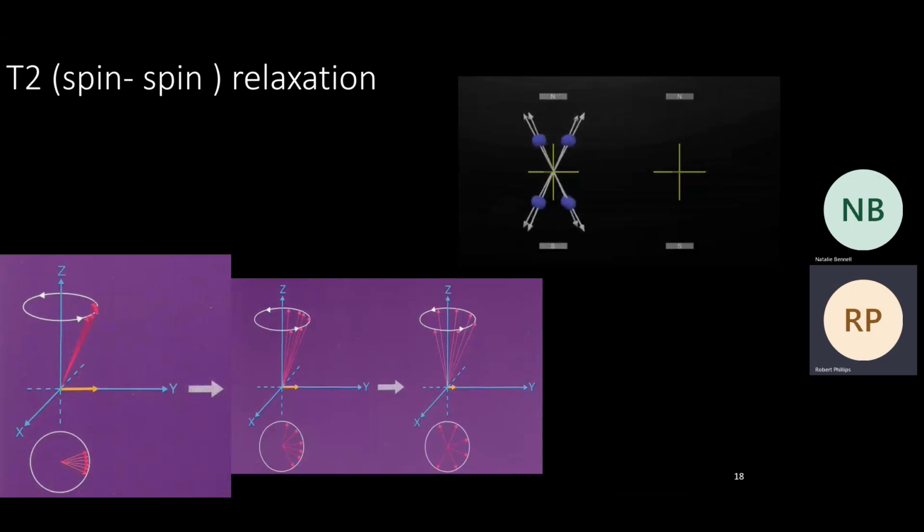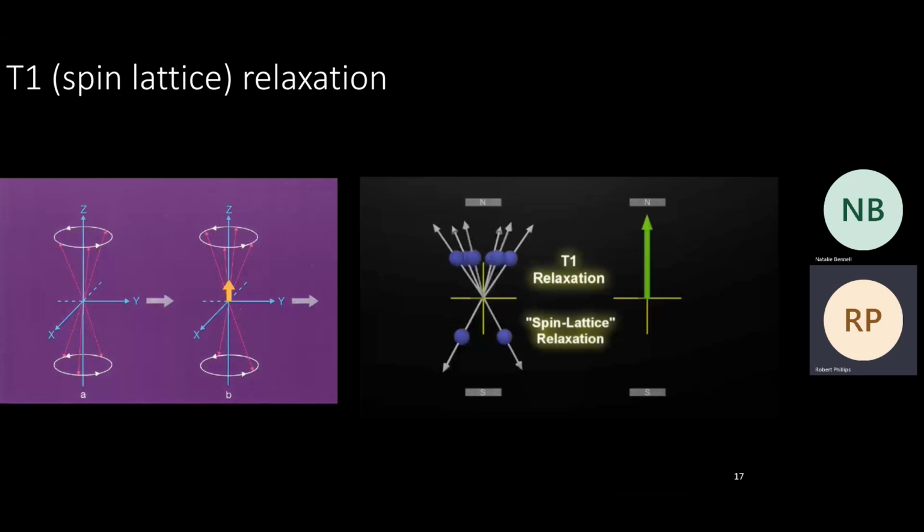So is it clear? All right, I didn't quite get the difference between T1 and T2. No, I'll come to that. T1 weighted image and T2 weighted image are different. This is T1 relaxation and T2 relaxation. So T1 relaxation is all about longitudinal magnetization, when it flips up and goes to its original position.